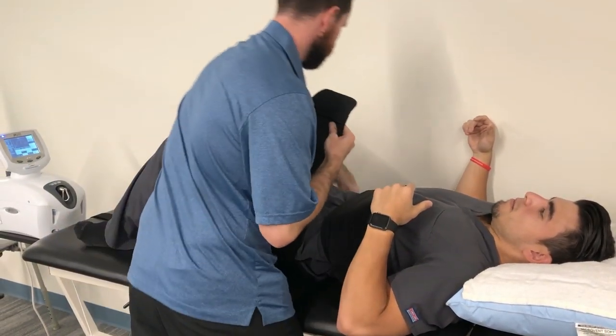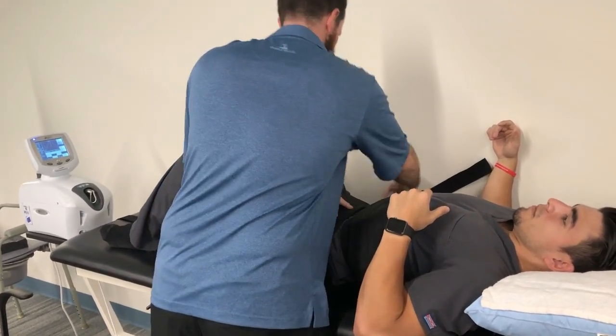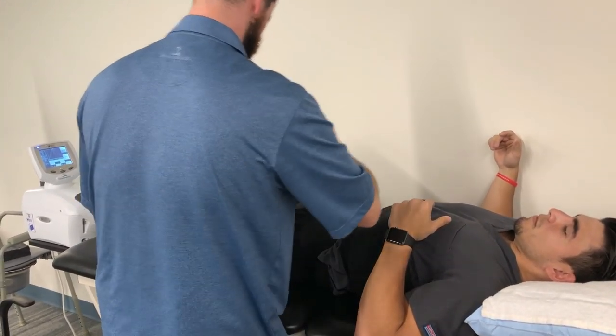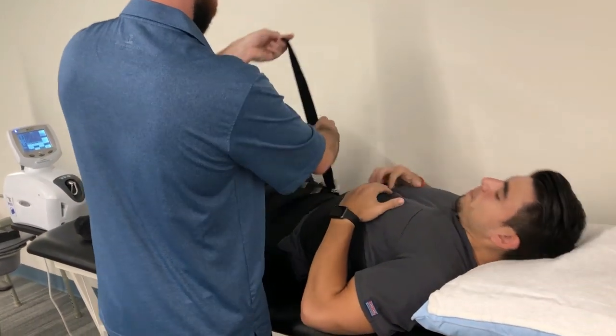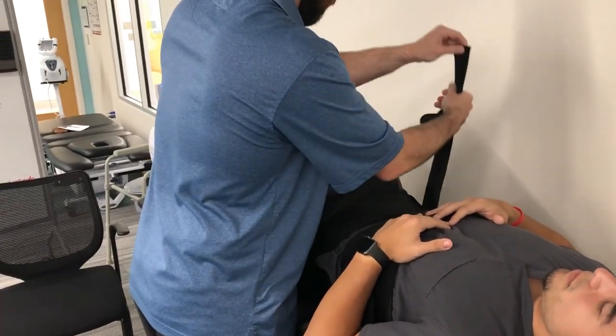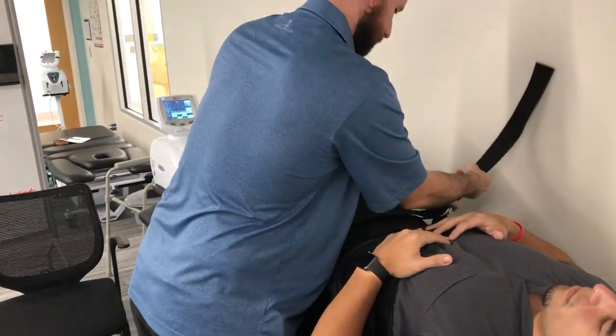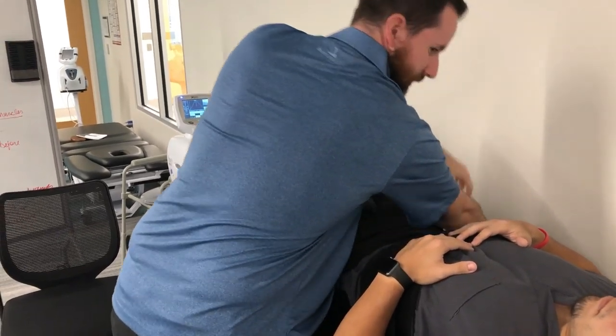Tight. Okay. And go ahead and wrap this around here. Tighten this one more time. Okay, does that feel tight there? Mm-hmm.